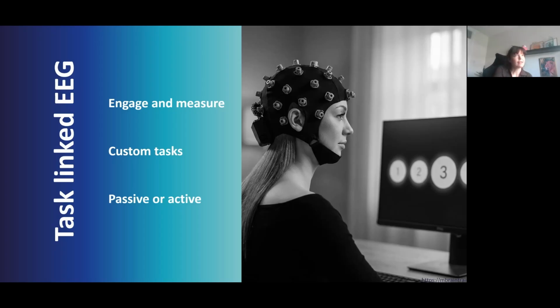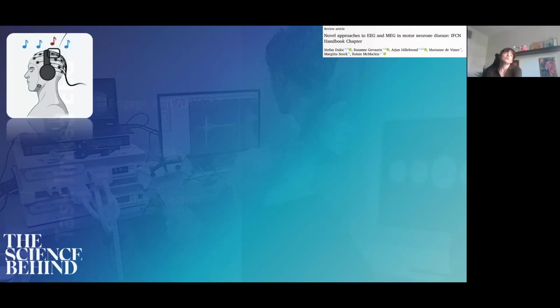So what does this look like in terms of EEG? Take a simple example of a task where your participant is undergoing EEG and you're playing a series of tones through some headphones. This is a very common example of an EEG-related task. And you want to test their attention, so you want to see if they're able to detect a target tone. Let's say these blue notes represent your non-target tones and your red note reflects the target tone.